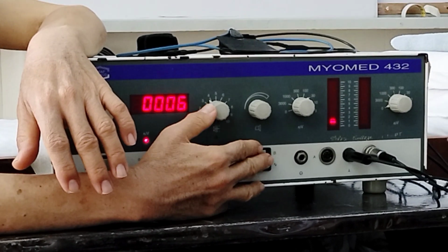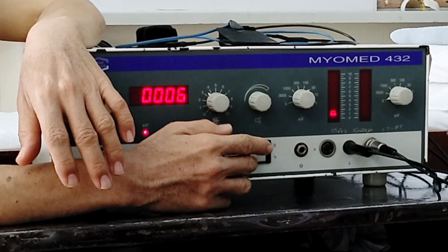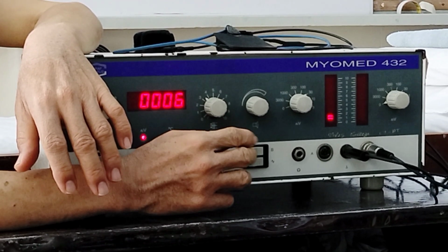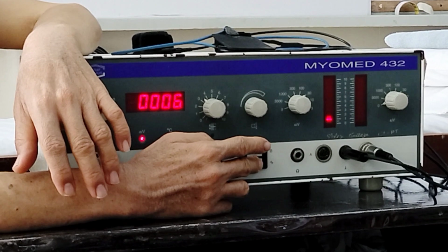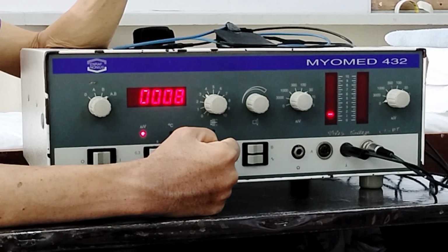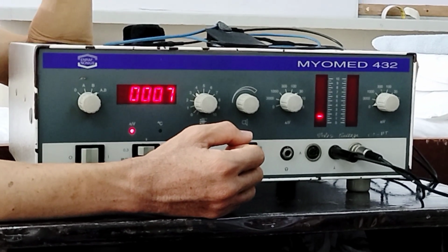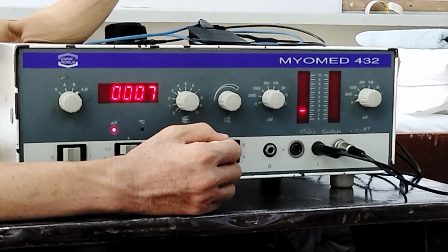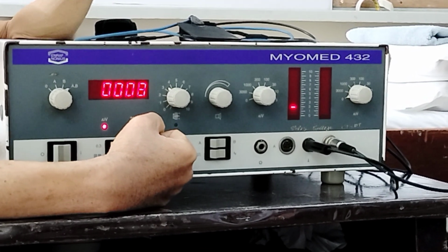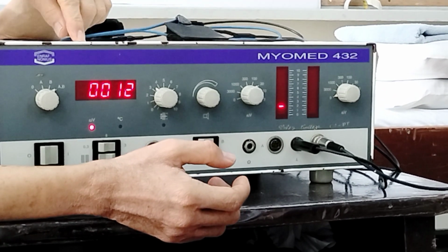There are some high-tech biofeedback machines that you can connect to certain music the patient likes to hear, so that when the patient contracts, the music becomes louder. If the patient barely contracts, the music is softer. If you are a patient who likes listening to your music, you will want it louder, so you are encouraged to contract to make the sound louder. If he relaxes and the sound is only soft, he won't like it.